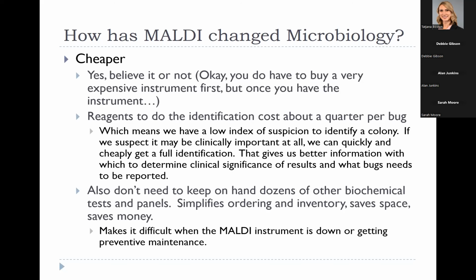But we need to get a lot more experience being able to identify these organisms and tell whether they are commonly clinically significant or common normal flora or somewhere a mix between the two. And this is my little gripe about MALDI, both of the manufacturers. There are some important organisms that aren't in the MALDI database.